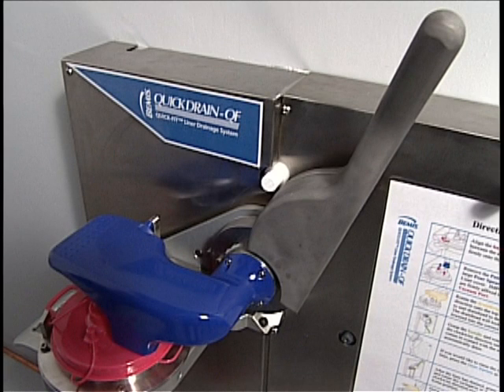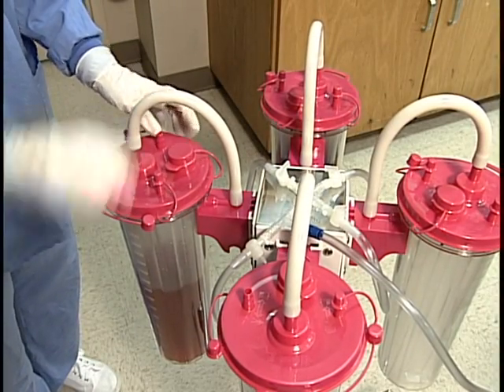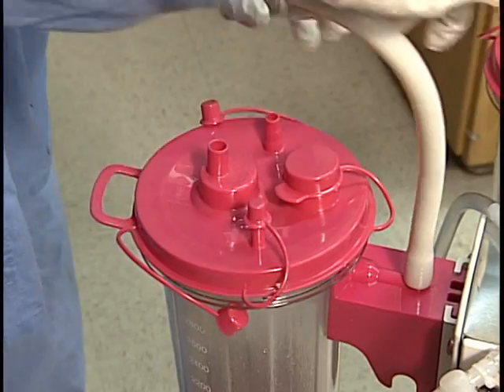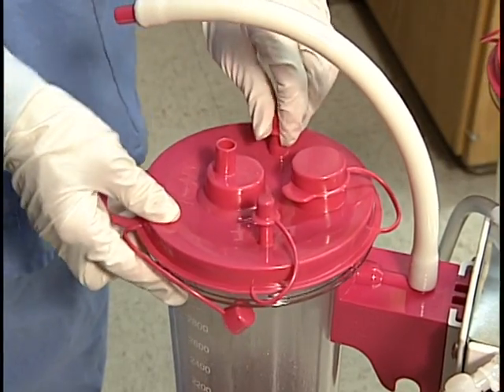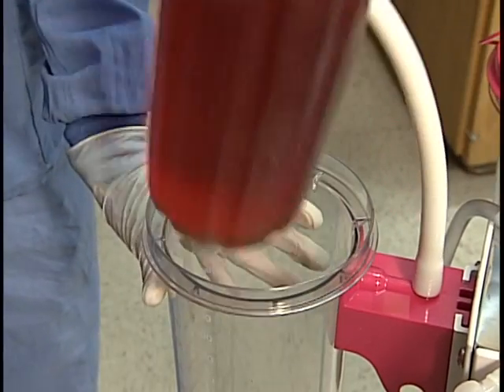The Bemis Quick Drain QF is designed for easy operation. Begin by disconnecting the quick fit liner from its canister. Remove all connections and cap all ports. To remove the liner, lift the handle to release the seal and lift the liner out.